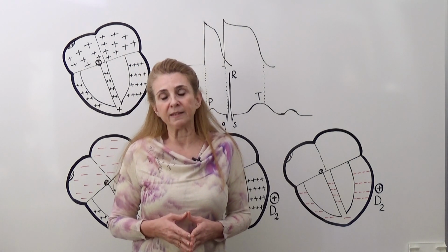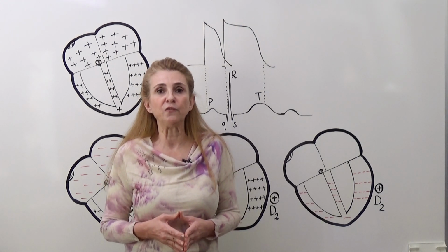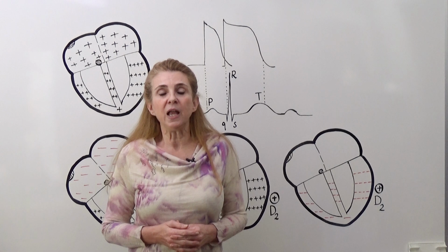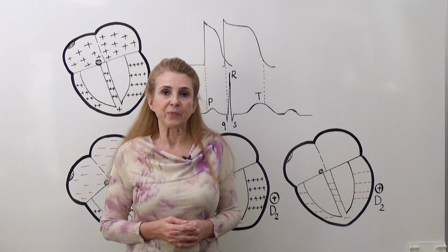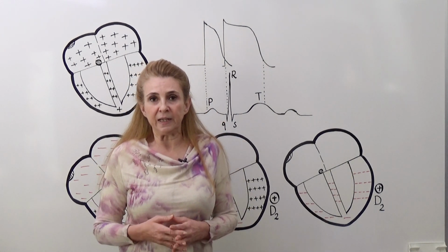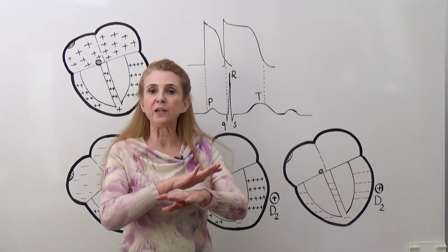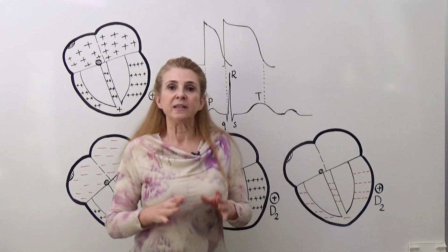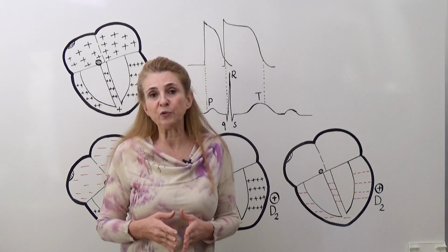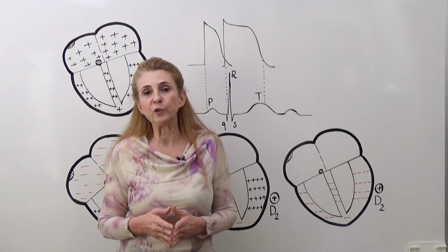The first point is that electrocardiography reflects the depolarization and repolarization phases of the action potentials that are formed only and only in the atrial and ventricular muscle cells. The 12-lead electrocardiography that we use routinely places the electrodes on the surface of the body. The electrodes are in contact with our skin, and a surface electrocardiography like this is able to record the depolarizations and repolarizations of the action potentials that are only formed at the atrial and ventricular muscle cells.